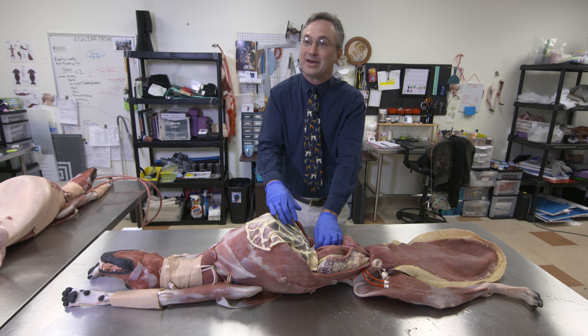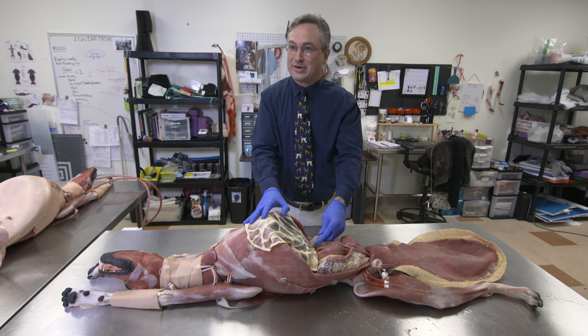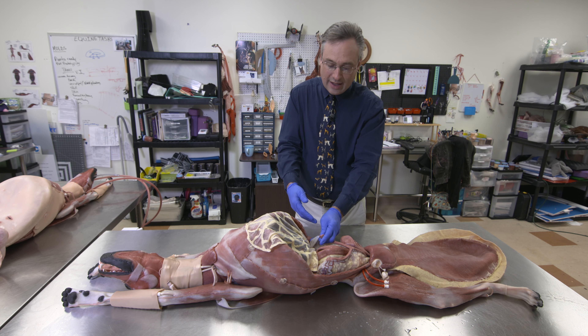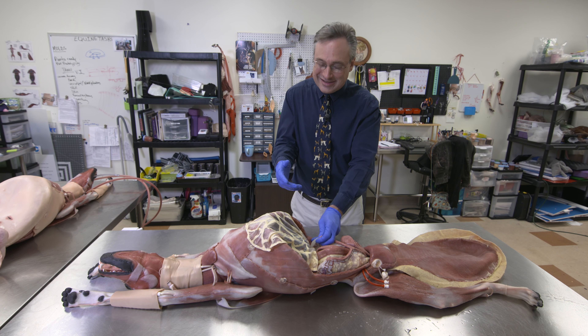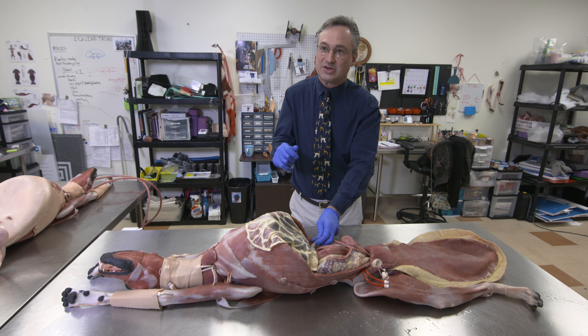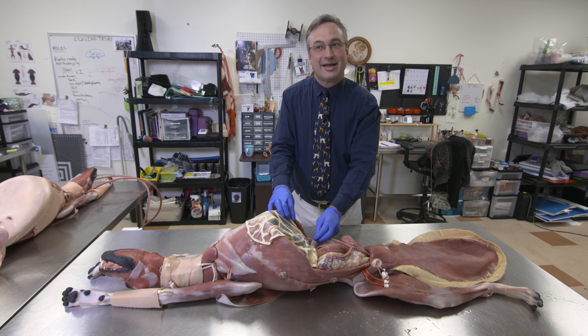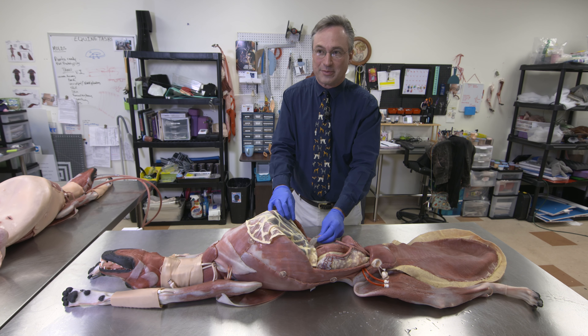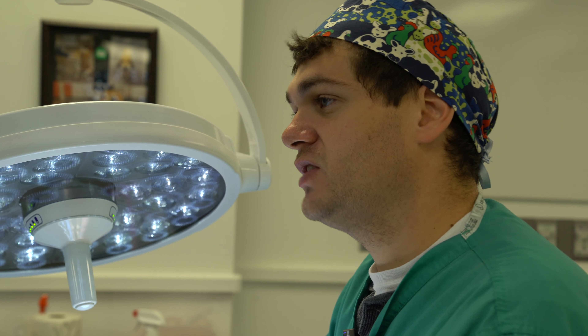One of the concerns we have as surgeons who might do an ovariohysterectomy is a condition called a dropped pedicle. So in the process of doing this procedure, if you did not ligate properly — or were distracted, or you sneezed, or some problem arose — you might happen to not close the vessels that feed the ovary properly. We're going to set up a clinical scenario where one of their pedicles, secondary to a spay that they've been doing, is now bleeding.